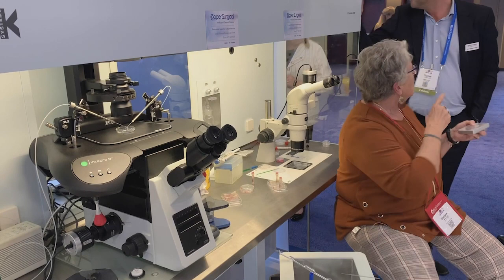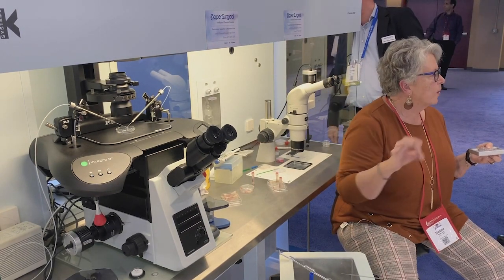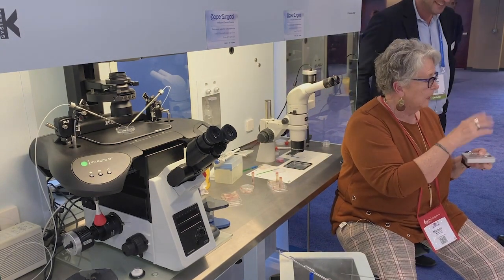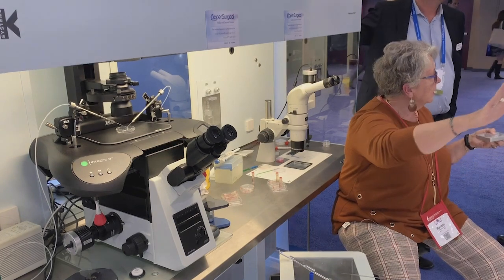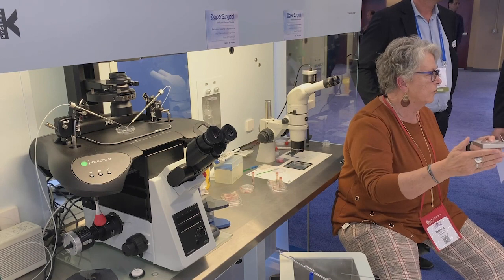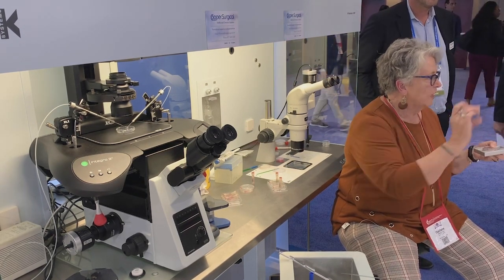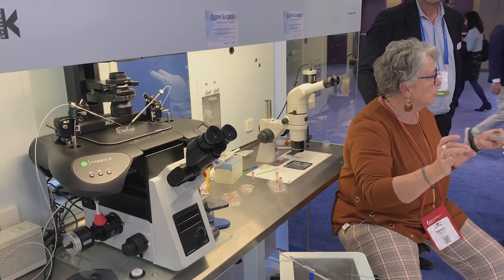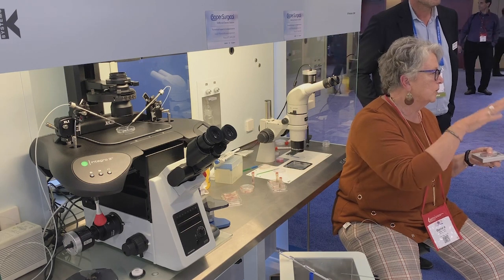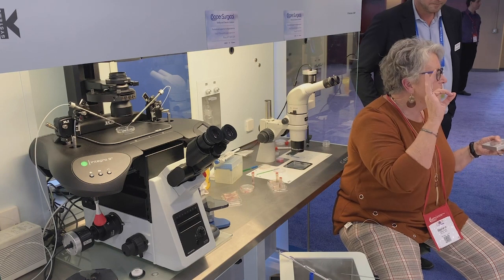I know I've gotten the high sign, I'm running out of time, but the important things are to get from here into here quickly and bring it out as the very last thing. You want that temperature to stay between 37 and 38. Everything you do, if you pipette it, is going to cool it down. If you flip this back and forth, it's going to cool it down. It's not so much with blastocysts that temperature is critical, but with eggs, it really is. So it's the small things.